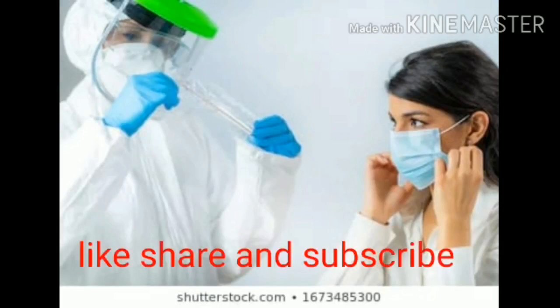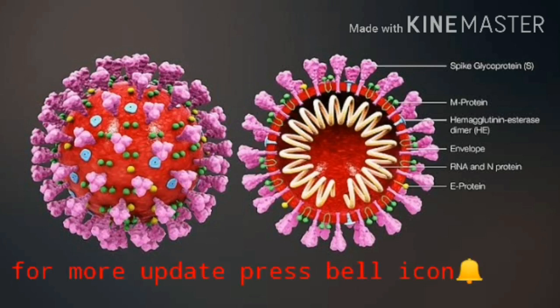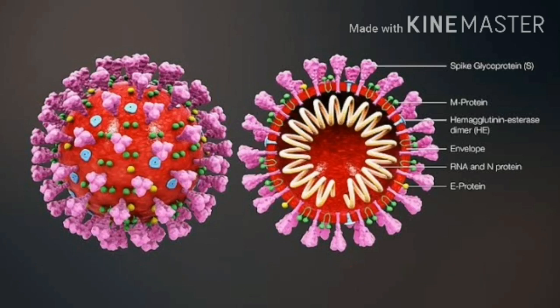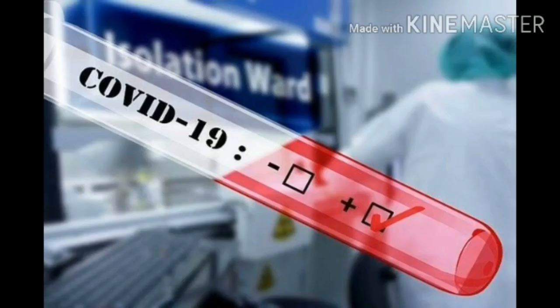COVID-19 diagnostics, performing a nasopharyngeal or oropharyngeal swab. It is essential to follow proper infection control measures when samples are collected from patients with a suspected coronavirus infection. Among other things, the examiner should wear an N95 respirator mask, gown, protective goggles, and gloves. To save resources, we will refrain from using each of these items in this video and instead only show the technical details of sample collection.